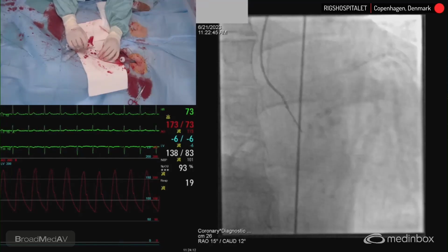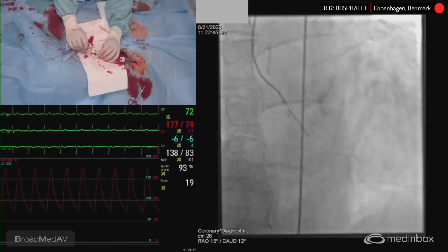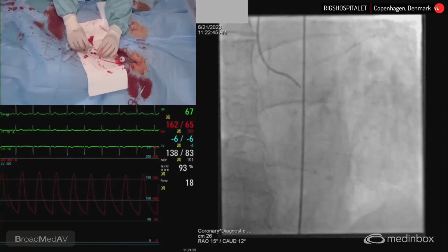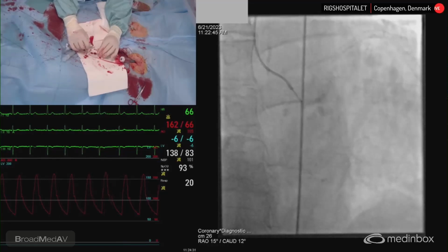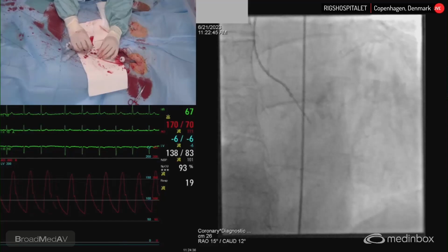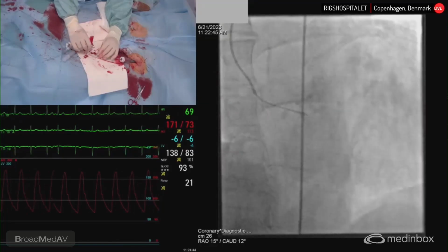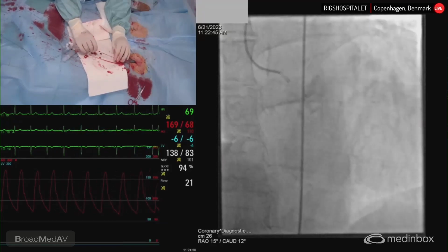Can I just see the CT again on the image there, how much is the STJ? Is it the big STJ maybe? I didn't think so, but if we turn the page there, yeah, STJ. STJ is indeed not smallish, but it's not terribly large. It's around 29 to 32. It's not small, but it should be suitable for the anatomy of a 27 Acurate for sure. And then the sinuses are around 30 to 33. So it's kind of more routine. It's on a tiny bit larger touch, but kind of.